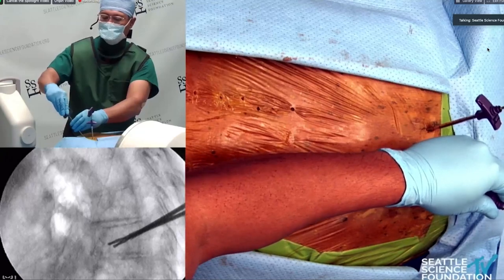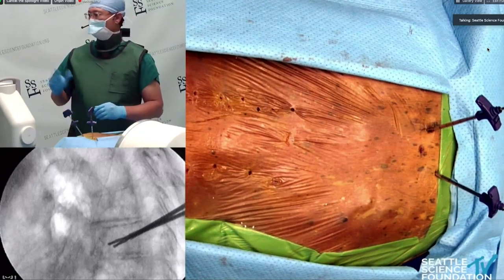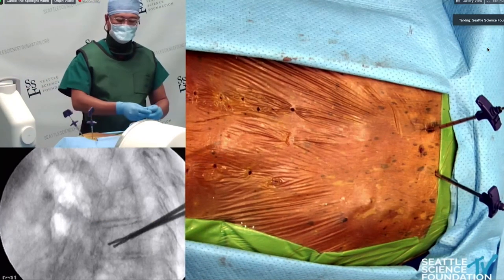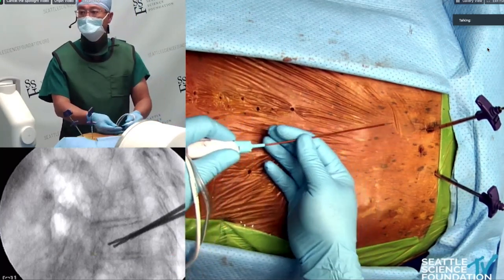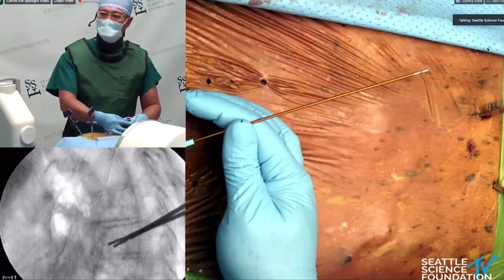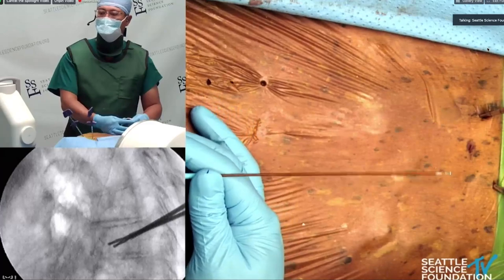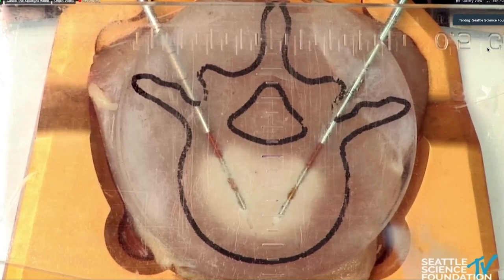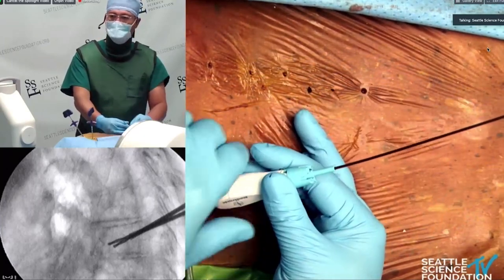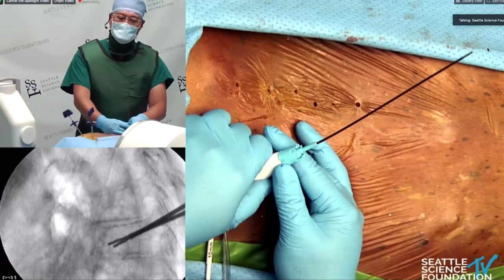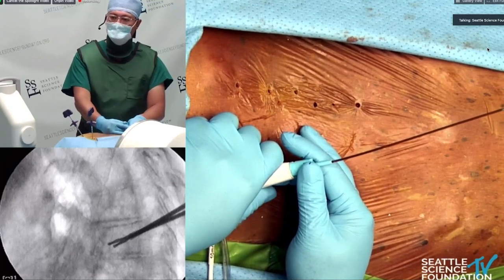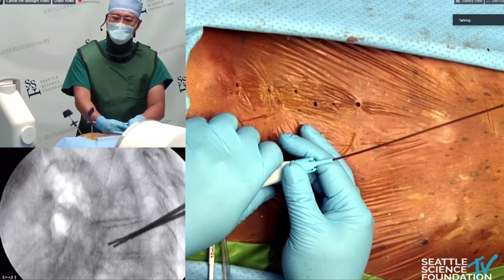We'll drill up to the yellow demarcation on the drill for both sides, and we would have a probe that represents that particular size in which we would do the actual ablation. In the chicken model demonstration, the ablation is in process. The Osteocool probe has an internal cooling mechanism where distilled water flows through internally so that the tip of the probe in contact with tissue stays cooler, so as not to char the local tissue. This allows for a higher and larger lesion in the area.